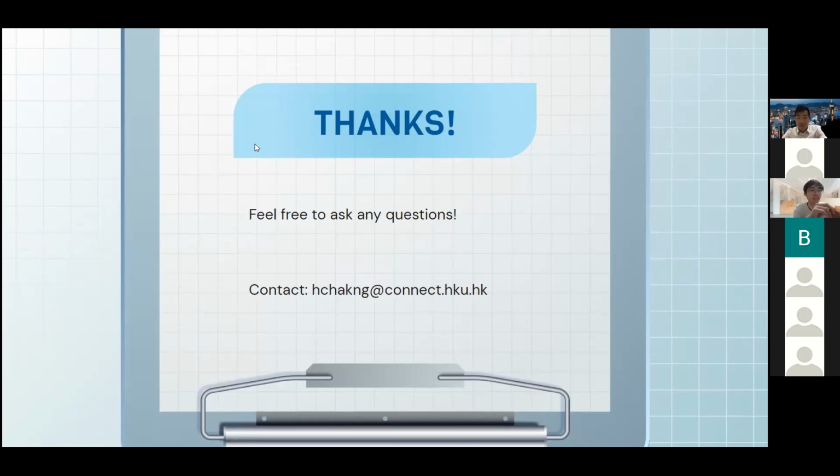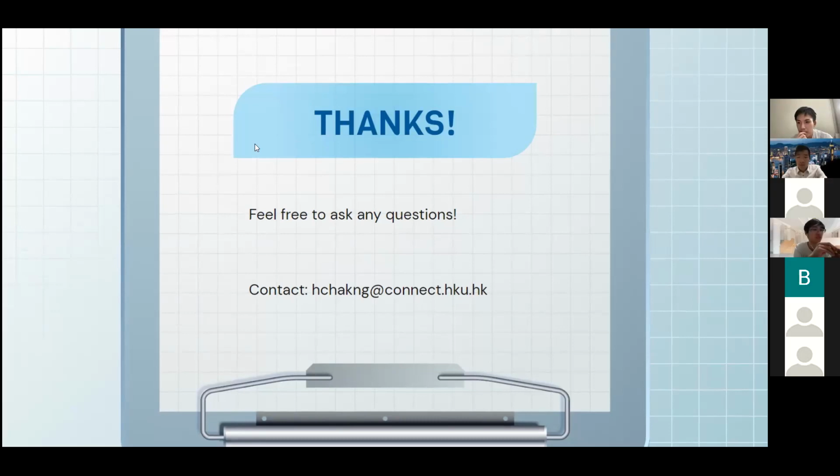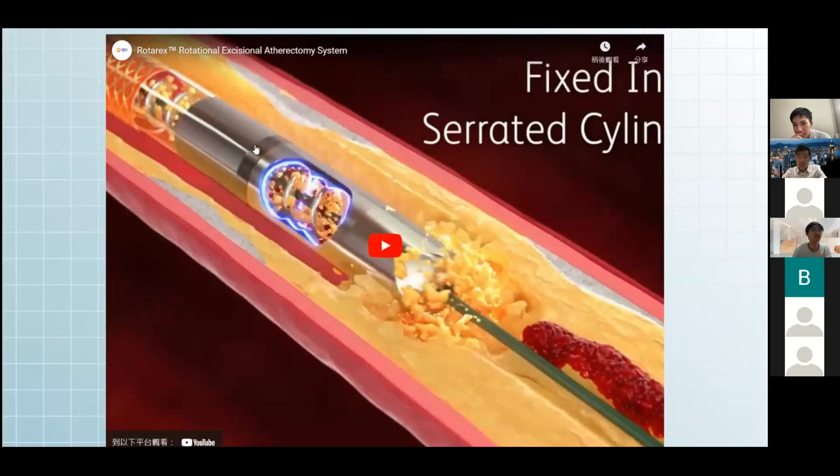In terms of this procedure, if you damage the endothelium, you will actually get some sort of response. And if you drill away, of course, there is a risk of actually harming the vessels, but compared to angioplasty, it is actually similar in terms of the complication rate. So I can say it's pretty safe.